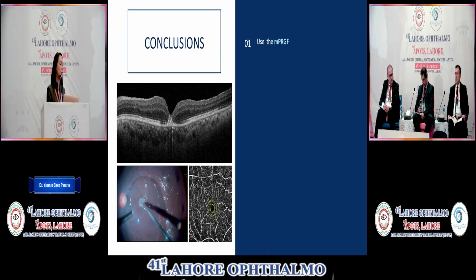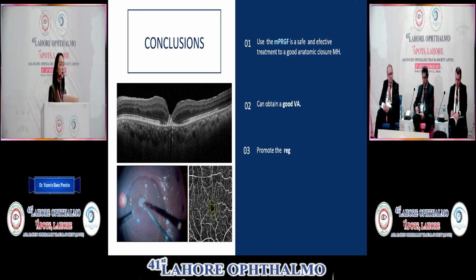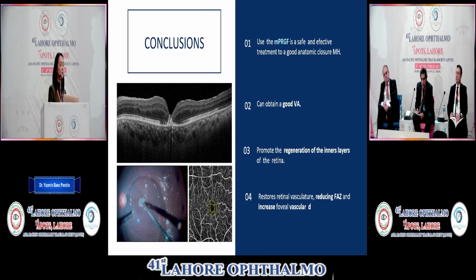In conclusion, we can use the membrane. It's secure to do it. It's safe. We can obtain a good visual acuity. We can promote the regeneration of the inner layers. We can restore the retinal vascular, reducing the avascular zone and increasing foveal vascular density.